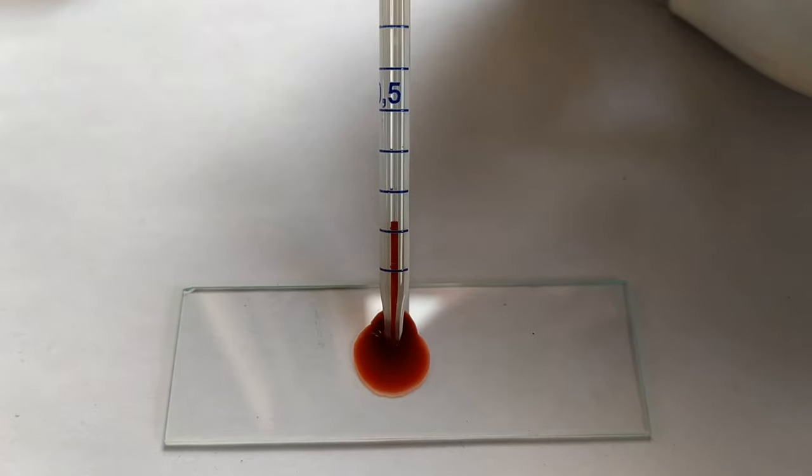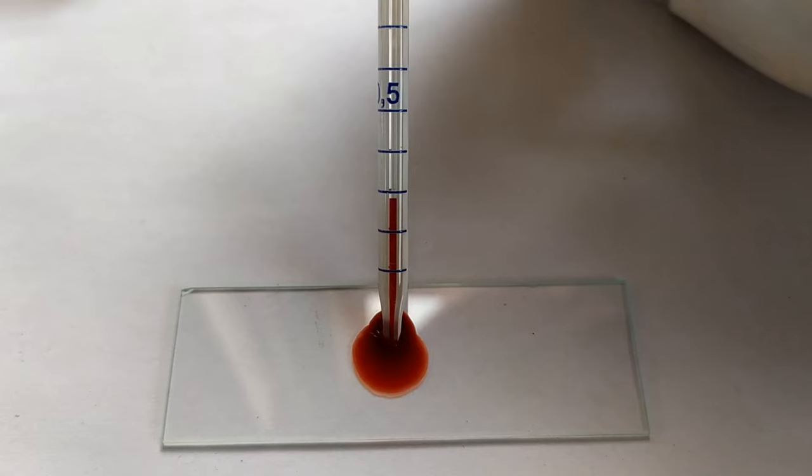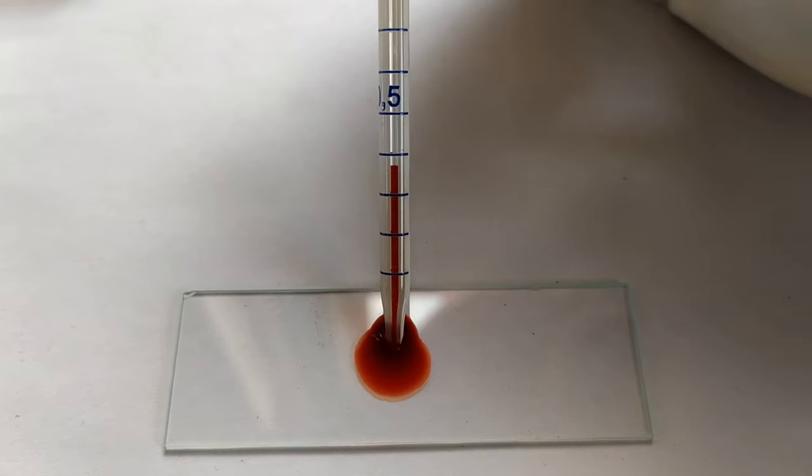If you happen to suck the blood beyond 0.5 mark you can either use a clean filter paper to carefully blot out excess blood from the pipette tip or carefully blow out excess blood using a syringe until it reaches down to the 0.5 mark.